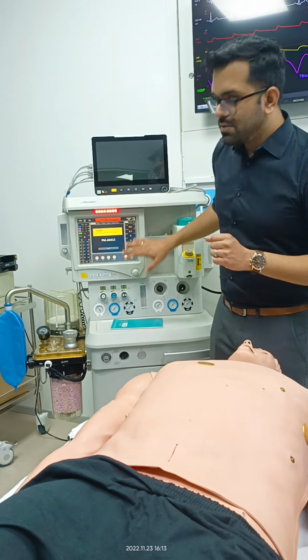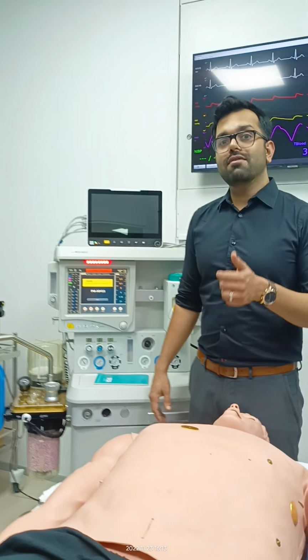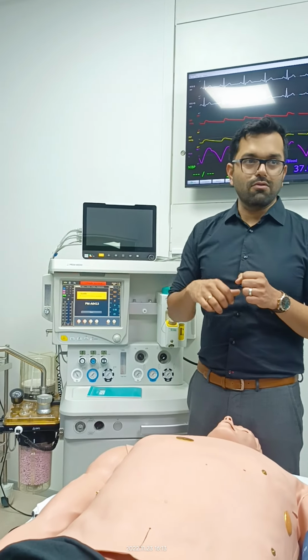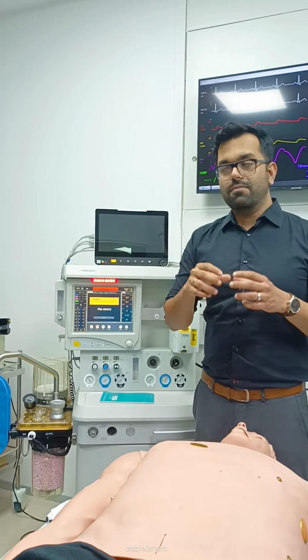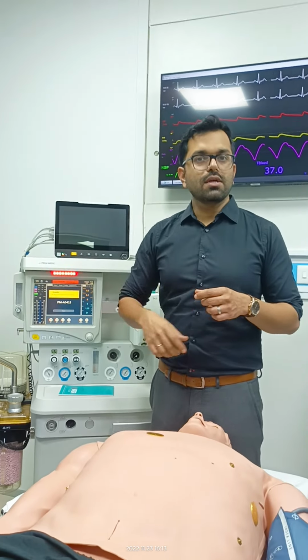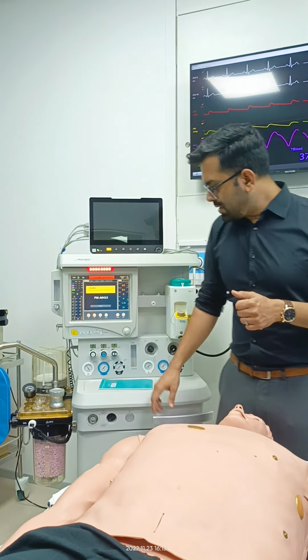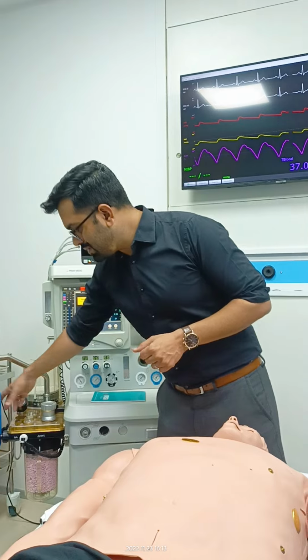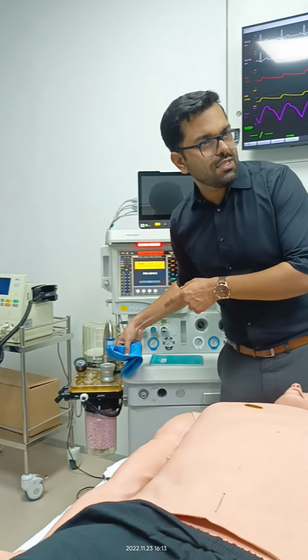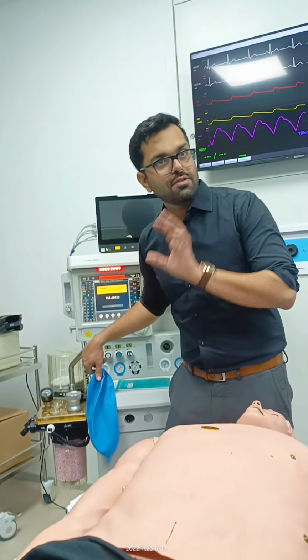So we use this machine. Once the patient is intubated, how do you give anesthesia gases? Through the endotracheal tube. It gets absorbed from the lungs into the capillaries, and then to the brain, and you get the effect. So how do you give the drugs? Your circuit is disconnected. You must have seen the machine, right? Anesthesia machine. This is the first time? Have you seen pictures? Yes.